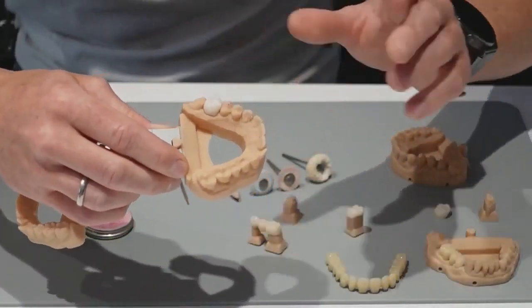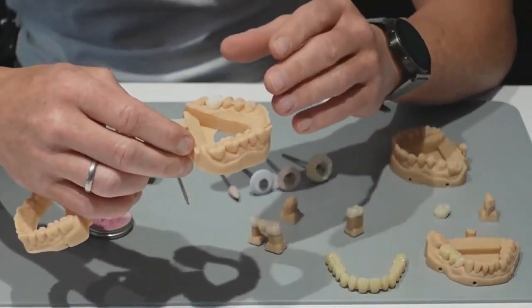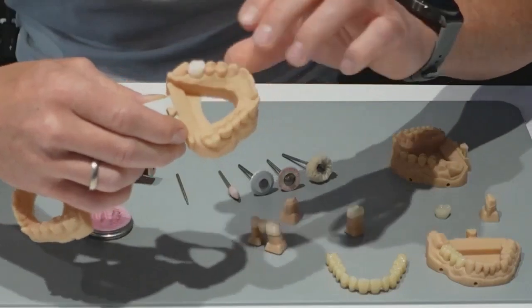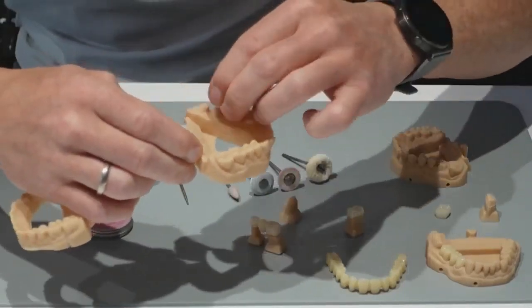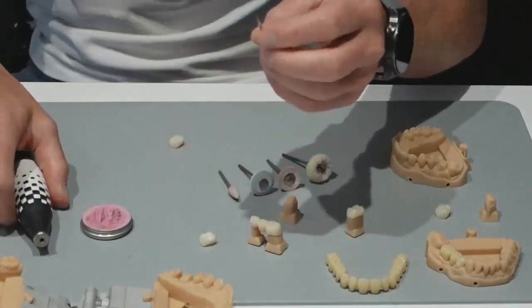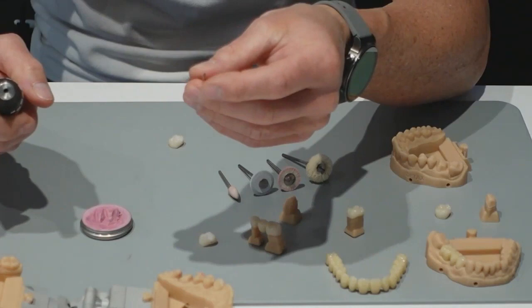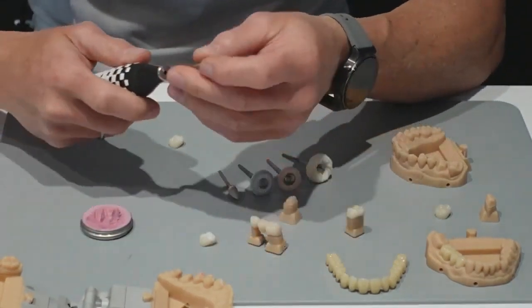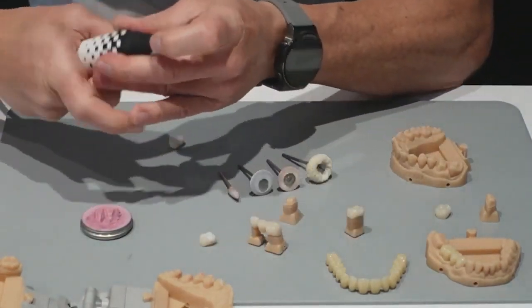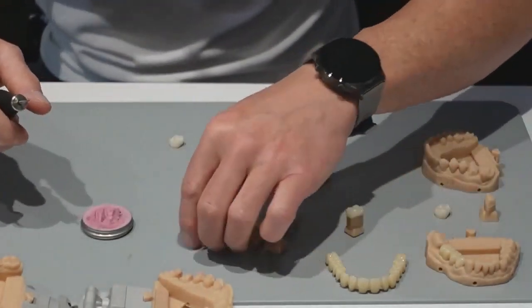The approximal contact is maybe a little bit strong, but you have to decide how strong you prefer. If you have this crown here, you can remove the rest of the support with any milling tools. So you work with dental technician knowledge.